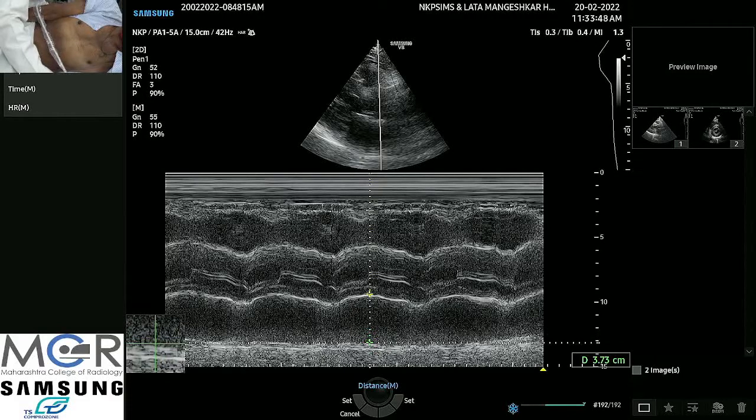Okay. Then another here. This is the aorta. Leading edge of the aortic root, you go down. This aortic dimension is 36. Almost the same, so there is no enlargement.